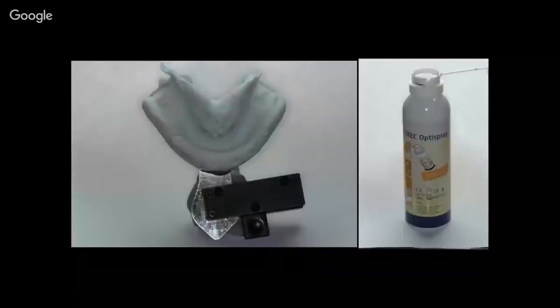This was a patient that I helped another doc out on. So saw the patient just needed a replacement lower denture. They had lost their denture. And so what he did that day was he just took an alginate primary impression of the lower arch. Okay, so that's what you see right here.